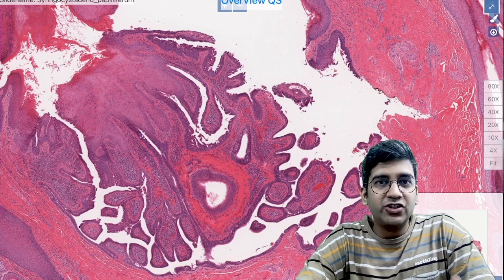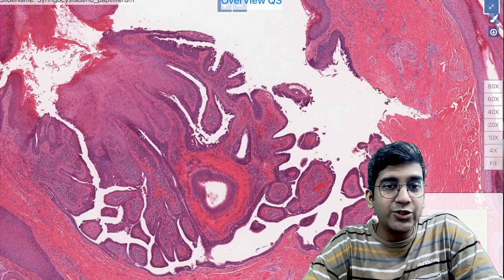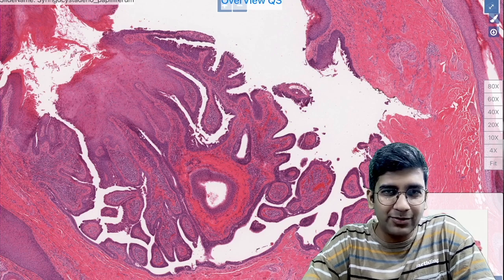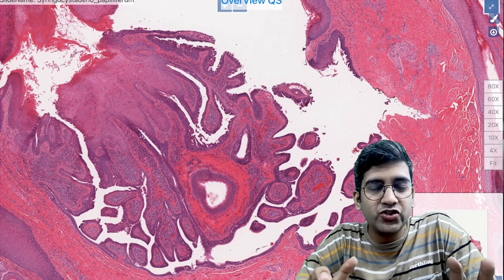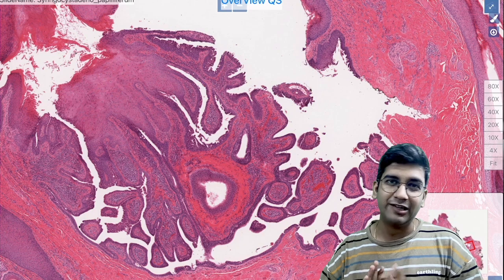The only thing with pathology is it's very vast, and we have to pinpoint every single lesion so that we can easily diagnose them, right? So the exoendophytic lesion, you might have a little bit of verrucous hyperplasia of the epidermis. Sometimes a pseudoepitheliomatous hyperplasia of the epidermis also can be there, and the double layering of the epithelium is very characteristic. And also books say that though it's not a very exact point to go for, the double layering and the transition is more than enough to diagnose.